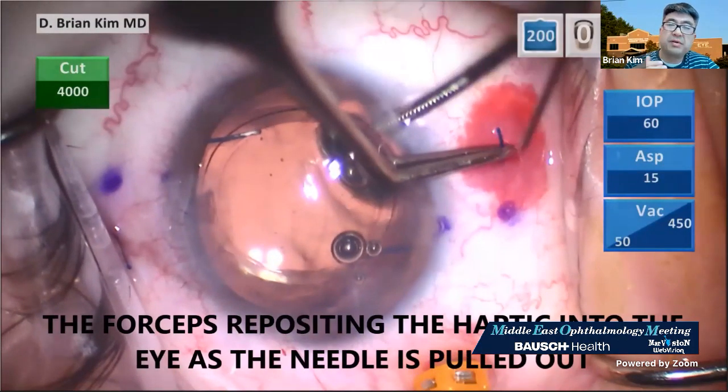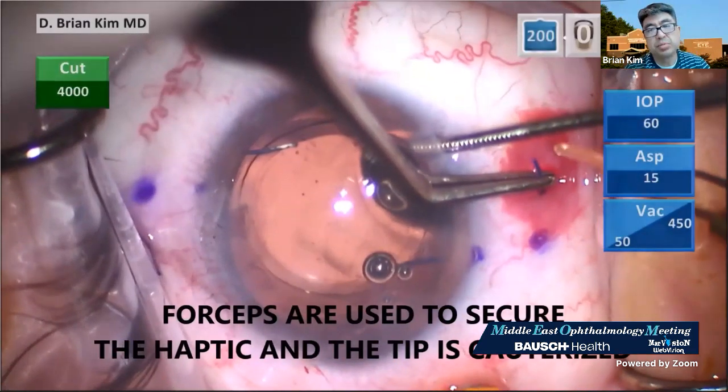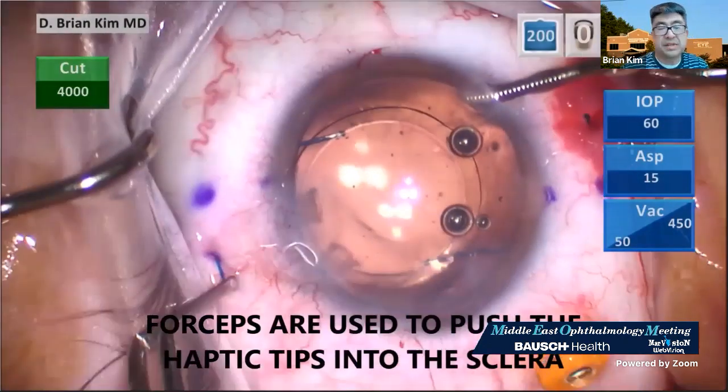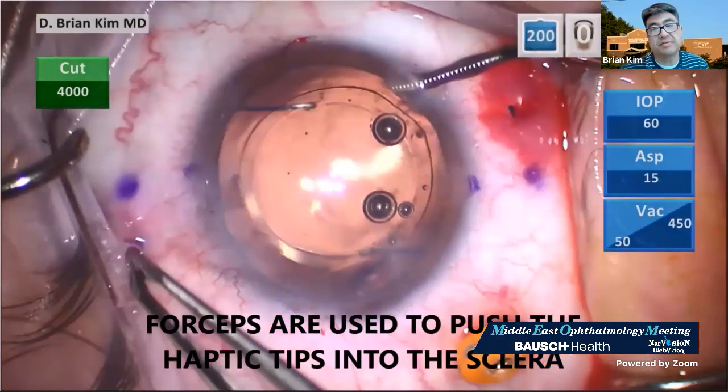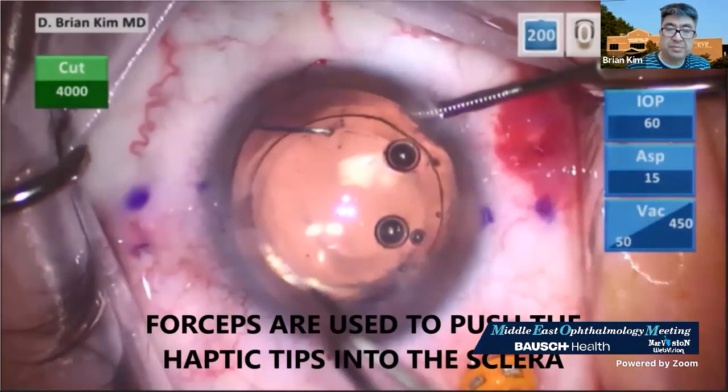You want to prevent externalizing the haptic too much on the left side, because if you pull too much of the haptic out, that means you're actually potentially pulling the right side haptic out of the needle. And then you push the haptic tips into the sclera.